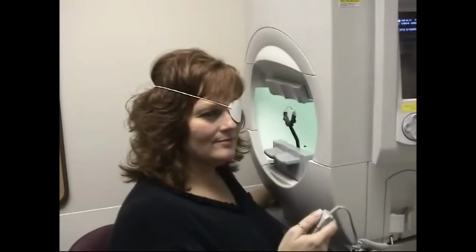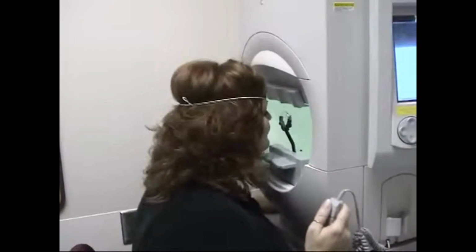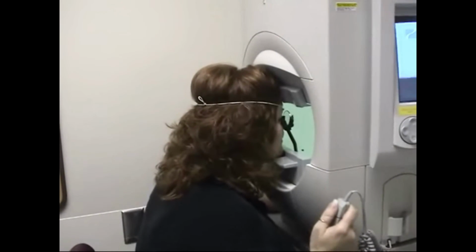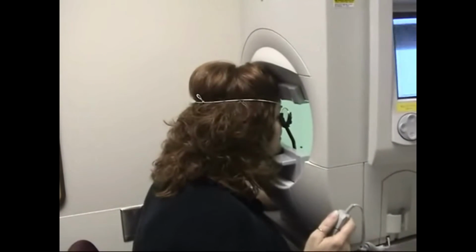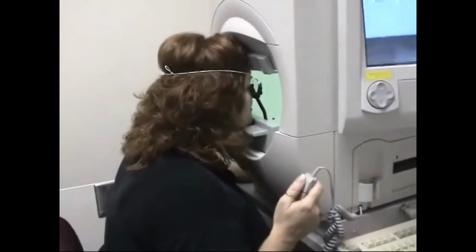Formal visual fields are usually performed by placing the patient's head in a white bowl and having her maintain her gaze straight ahead. Lights of different intensities are projected onto the bowl, and the patient is asked to press a buzzer if she sees the lights.